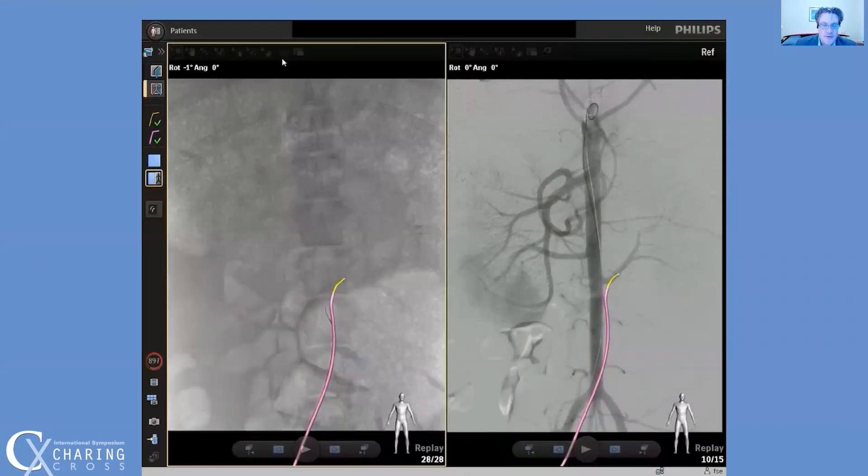Here is cannulation of a renal artery in a pig, using a DSA image as a roadmap. The catheter and wire are visualized much better than with a standard roadmap image using fluoro. The colors stand out and are in the foreground relative to the roadmap images.